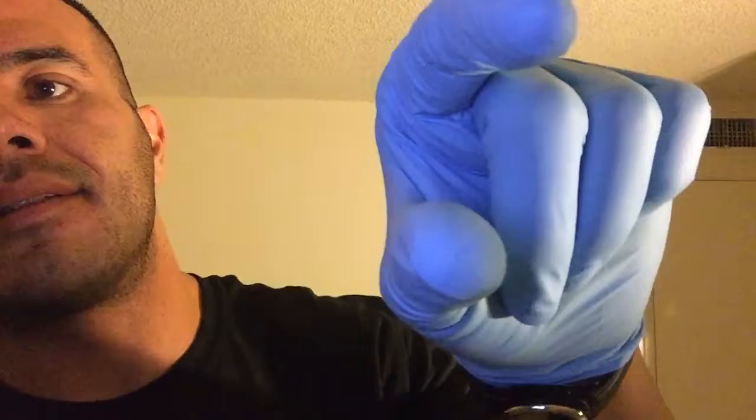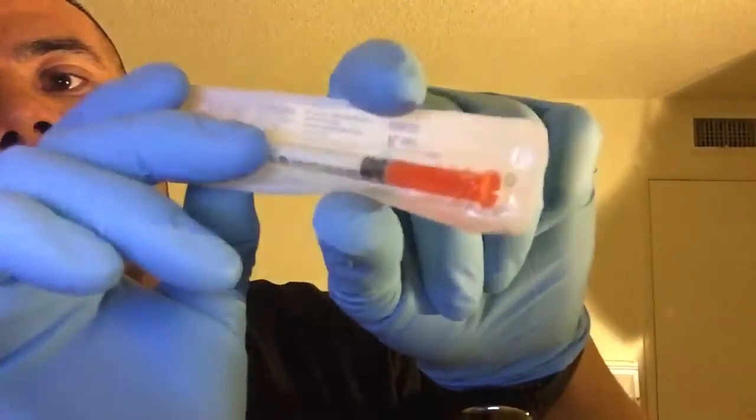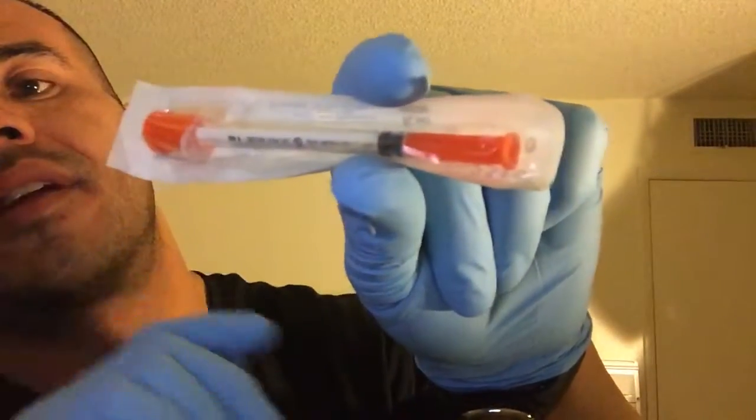So I'm going to get my alcohol swab, and I'm going to clean my injection site. And the insulin is actually a little bit easier because once we've cleaned our spot, we're just going to pinch the skin a little bit, like a little piece of fat, and we're going to insert our needle, inject our medication, then let go, pull out all at once, and toss our syringe into the sharps container.